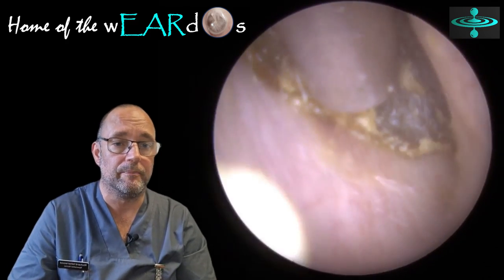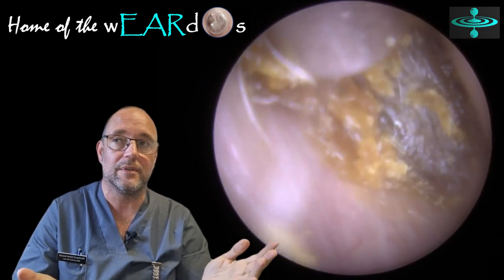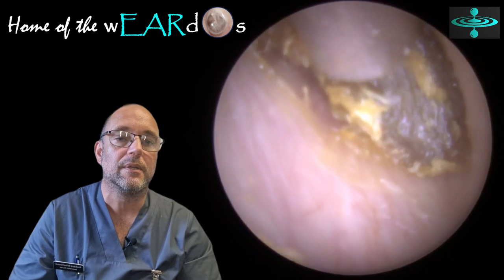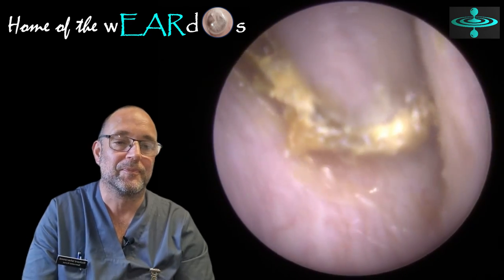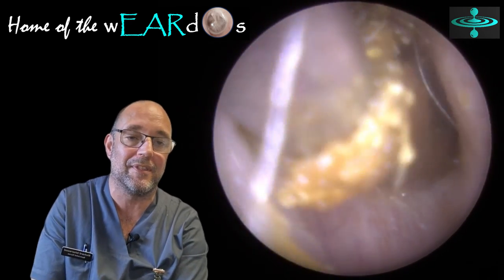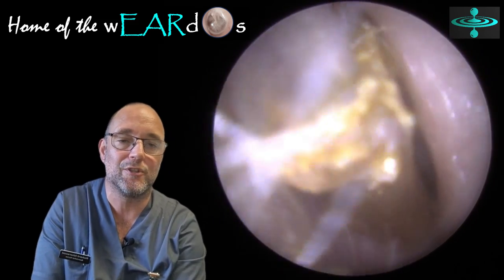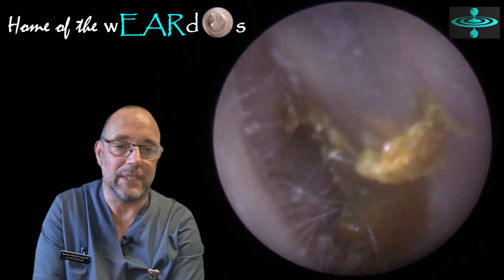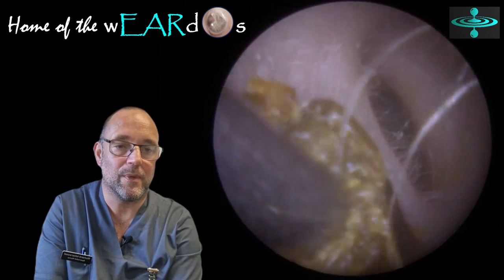I often compare it to a hoover — not saying stick any orifice in a hoover at home. But you'll notice if you get your hoover attachment and stick your hand over the top, the power in the machine goes up. It's working harder. Don't try that at all. I've heard some stories about things being stuck in hoovers when I worked in public health — the things that people used to turn up to accident and emergency with. I won't go into any detail. But finally I've got a good old grip of that one, and it's still taking a bit of persuading.